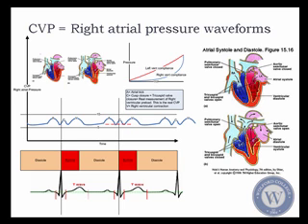Okay, so when you're measuring CVP, you shouldn't be looking at just the total waveform, but you should just be looking at this point right here, which is where the C point is. So this is really the more important value that you need to look at here. That's where your CVP is truly measured, as you can see by this red line.